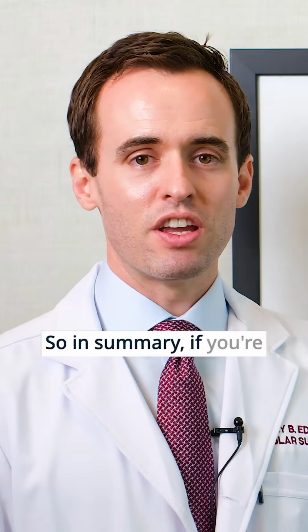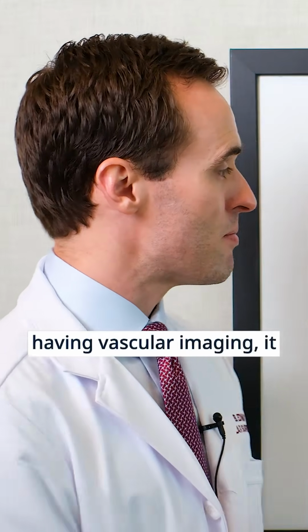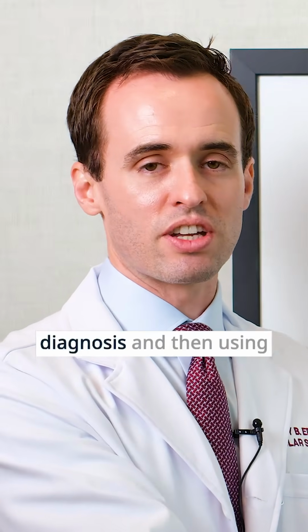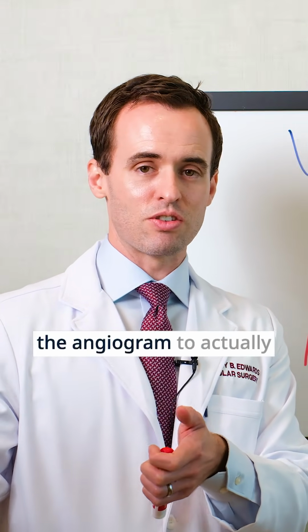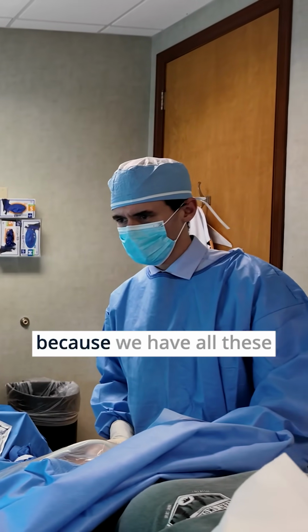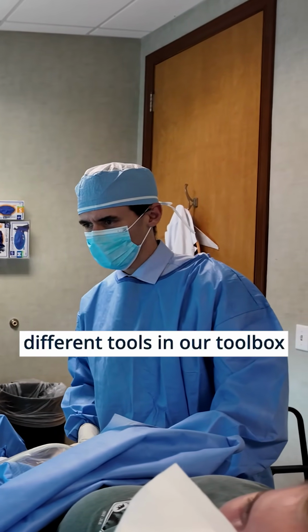So in summary, if you're having vascular imaging, it might involve all of these in an effort to get the initial diagnosis and then using the angiogram to actually perform the surgery. Vascular surgery is exciting because we have all these different tools in our toolbox that we get to use every day.